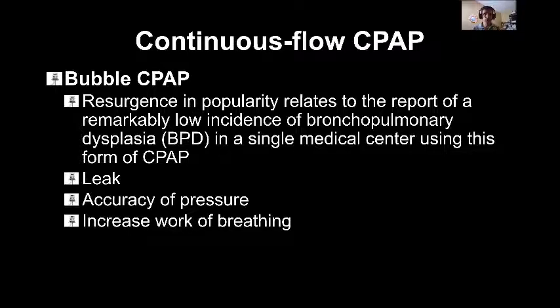The other problem of bubble CPAP is the control of the pressure, because remember, the pressure is always generated by flow, and the flow should be blocked. And usually with the CPAP machine, the block is the exhalation valve. In bubble CPAP, the block is the fluid, the water that we use. And because the distance between the interface and the fluid is a little bit long, when the patient breathes out, they will breathe against that column of circuit, which contains the pressure. And therefore, it increases work of breathing.